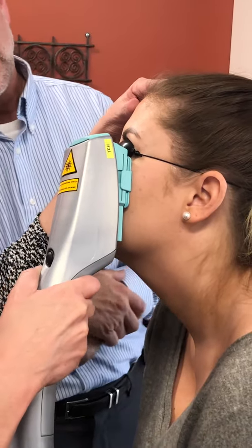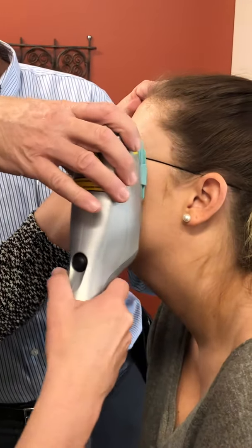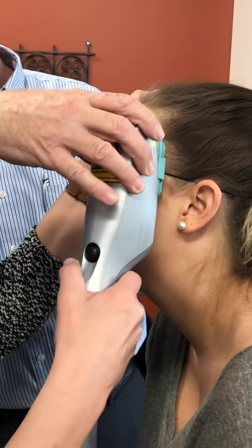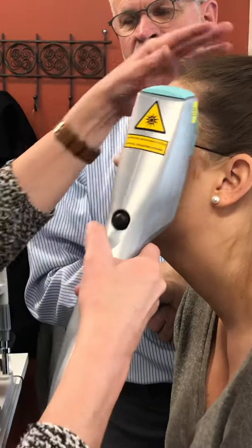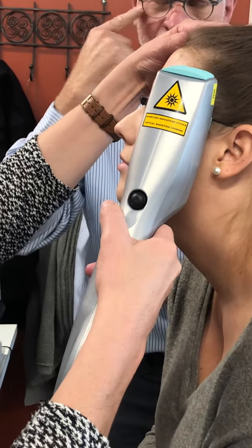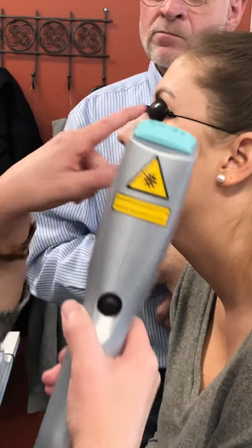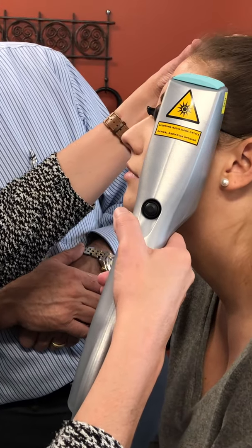Now come over, and then we're hitting it right there. Then this would be 3. Then we're going to come up and hit 4, okay? So it's 3 right in here. 4 is kind of coming up in this area up here, and then 5 is going to blend all the way across. So it's almost like the top of the crystal is lined up with her eyebrows. That's correct. Right there. And then we're hitting across again this way.